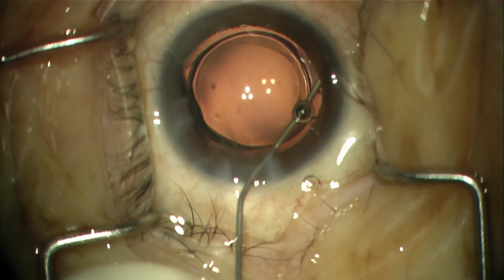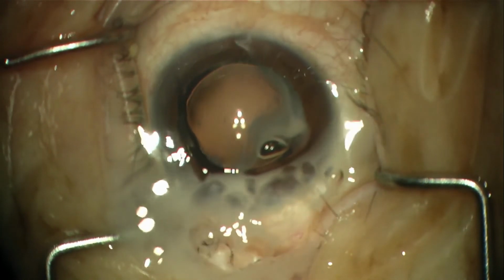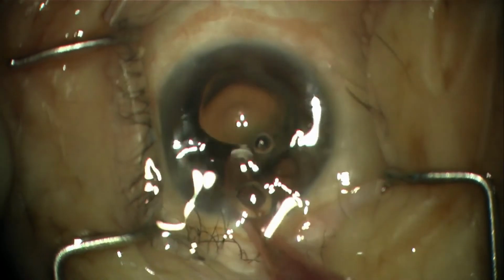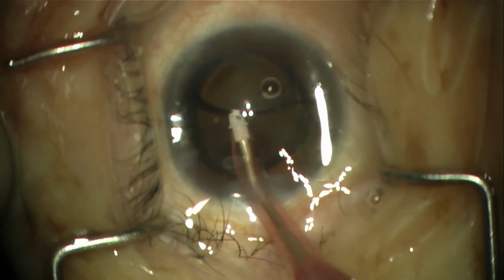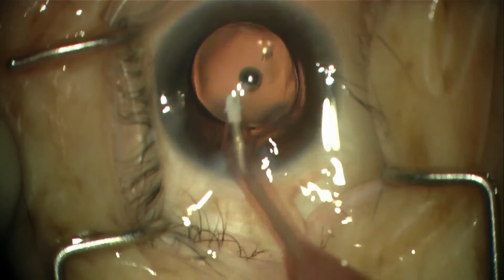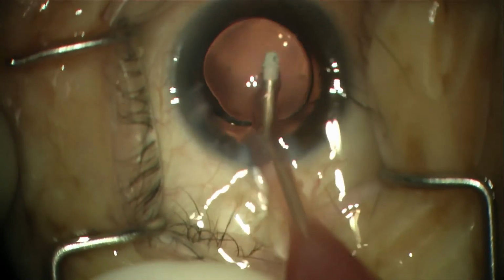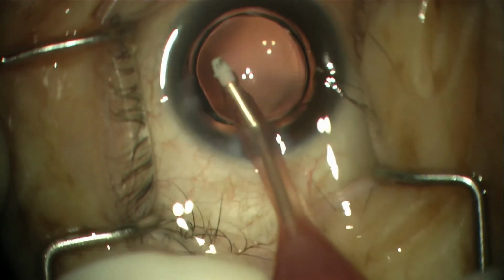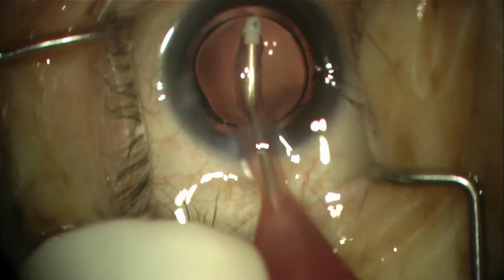We're now injecting some antibiotic as well as steroid, so moxifloxacin as well as triamcinolone. Now we are removing some of that viscoelastic because we don't want to retain it in the eye. It can cause intraocular pressure spikes. So we're actually removing the viscoelastic from behind as well as in front of the lens.